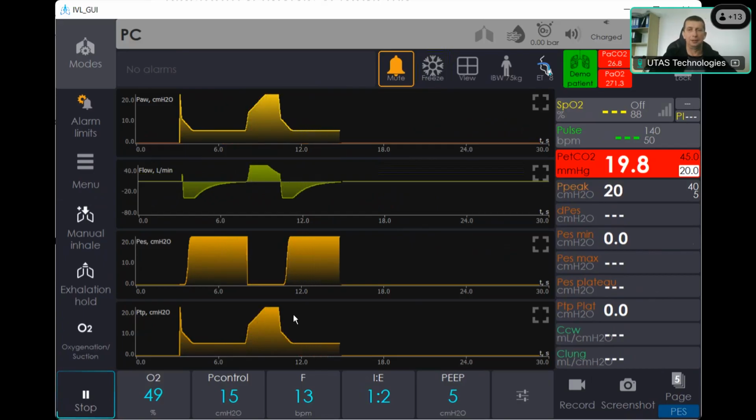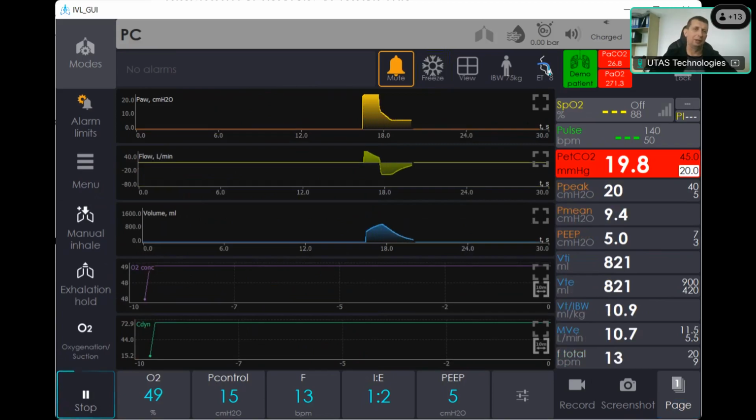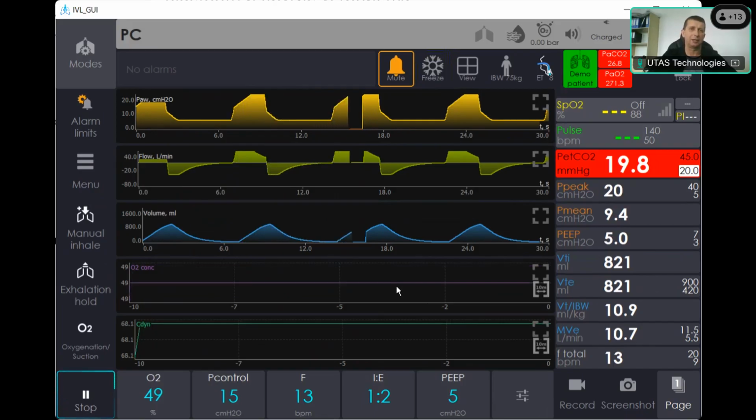It is intended for patients in critical conditions, where the balloon catheter is inserted in the patient's esophagus, and the balloon catheter pressure corresponds to pleural pressure in the patient's chest. It is helpful for the doctor to understand the breathing mechanics better and to correct ventilation settings according to these additional monitoring parameters.